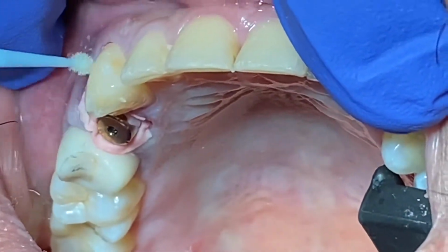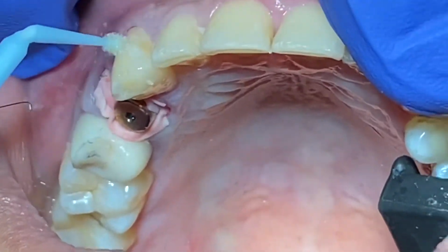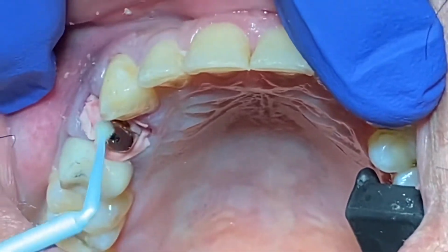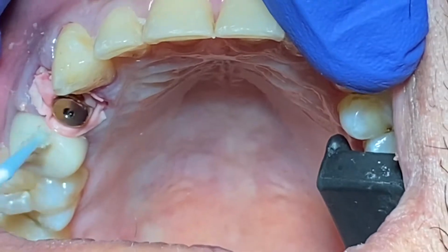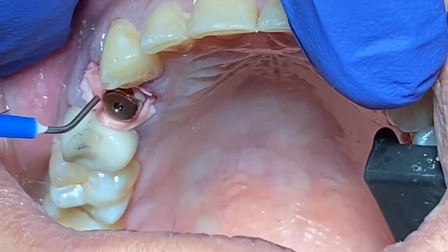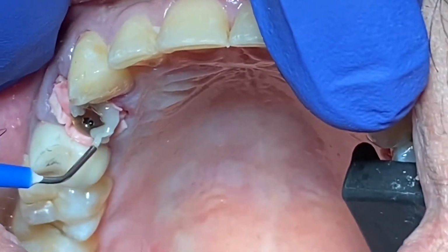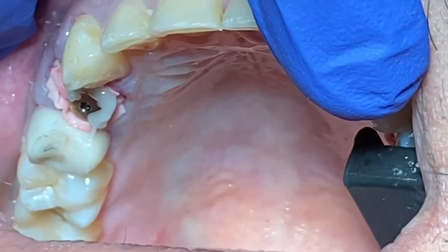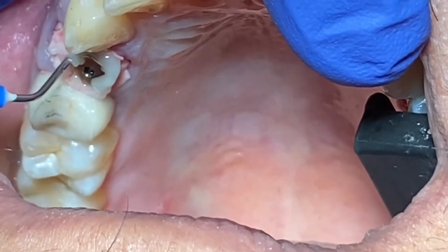and then what I did was I put some prime bonding in with no etching, just some bonding, so that's where I can put some flowable around the membrane and surround the membrane everywhere, to basically allow the membrane to be protected. And you noted that I don't put anything here right in the screw slot. That's where I can easily manage it through.